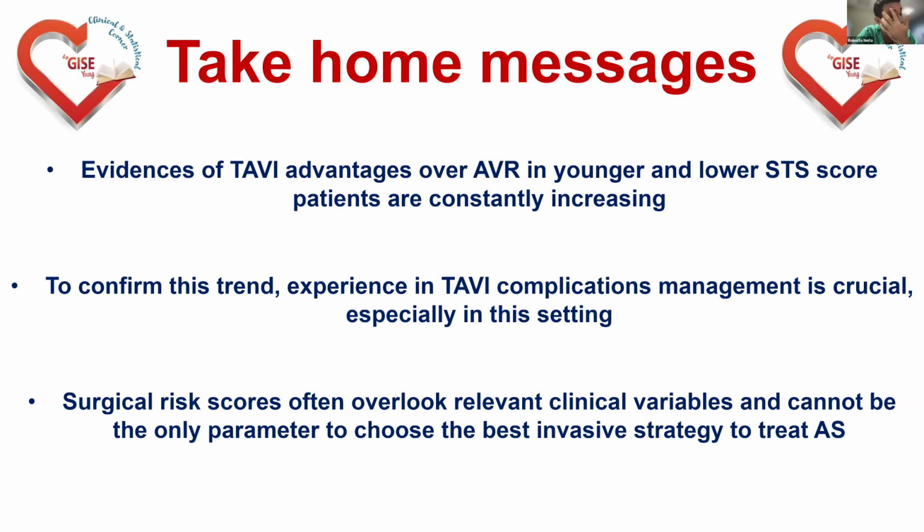Anyway, I believe that at the moment, with the currently available devices and what we know about bicuspid, very elliptic valve, a lot of calcium, young patients, many times associated disease of the root. So many things together. I don't think we are still at the point of telling that we are as effective as the surgeons. So we still have to say that bicuspid valves are surgical.